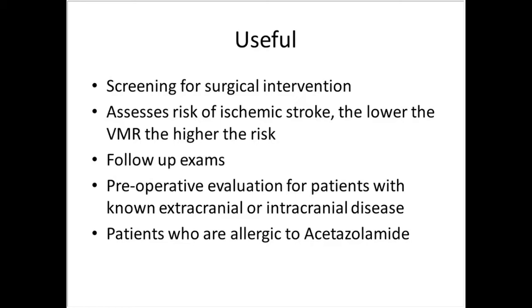We use it for preoperative evaluations for patients with known extracranial or intracranial disease, and for patients who are allergic to acetazolamide. Sometimes we even get referrals for patients that the doctors don't want to do a CT perfusion and radiate the patient. They just would prefer a non-invasive study.